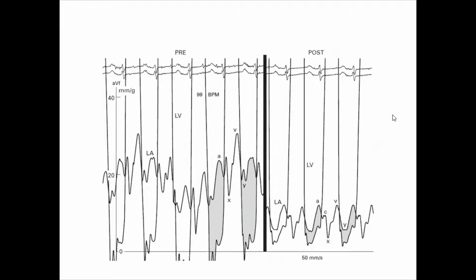What about the LA pressure? And we have also the LA pressure is high. It's high, yeah. Because this variation is most likely due to respiration. But if we took the mean, maybe around 20, the mean left atrial pressure is around 20. And I know that the mean left atrial pressure is around 5 to 8 or something like this. So high left atrial pressure, number one. Number two, there is the diastolic gradient between the LA and LV, indicating what? Significant mitral stenosis. Yes, severe or significant mitral stenosis.